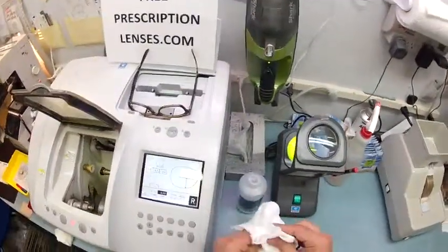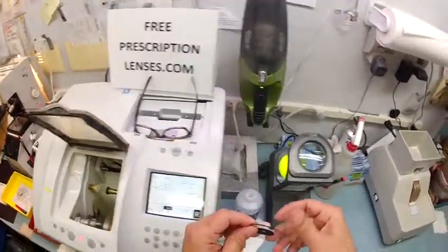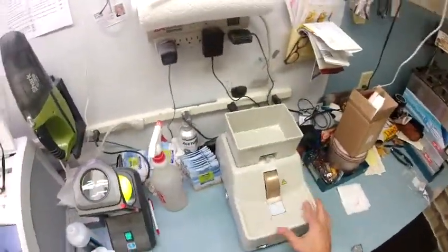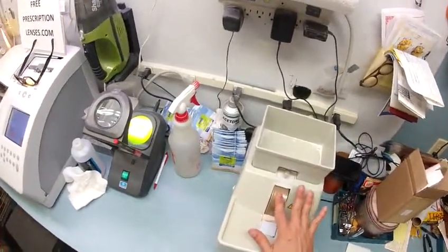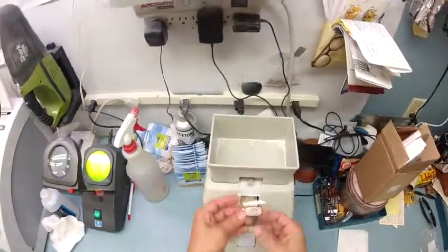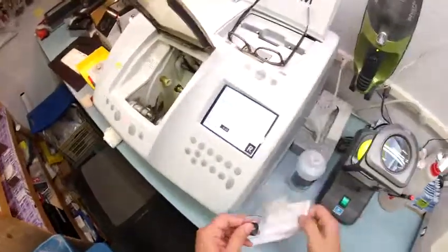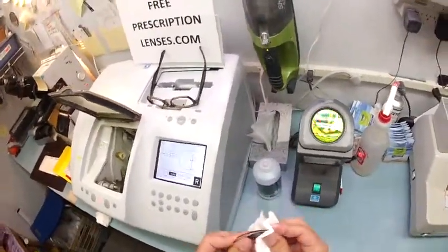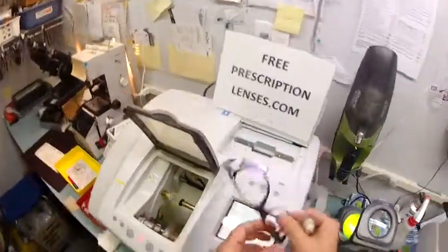So before I try and mount it, I'm going to dry it off, and then there's one more step. You still have a little bit of rough edges here, so I'm going to use my hand stone, which is completely flat. I can put my hand on it while it's running, and although my finger gets warm due to the friction, it's that friction that allows me to put what's known as the safety bevel. And I'm going to clean everything off around the edge of your lens now. And let's see if this will fit in there.